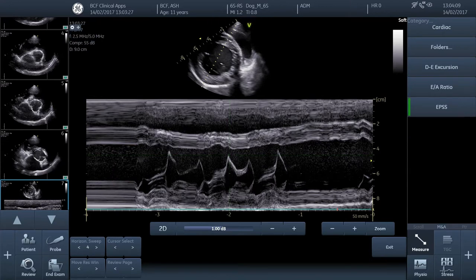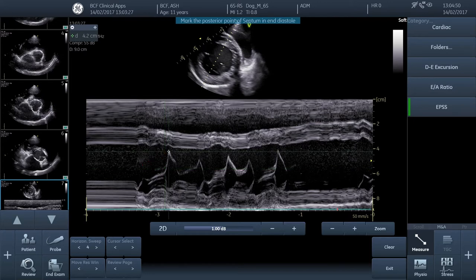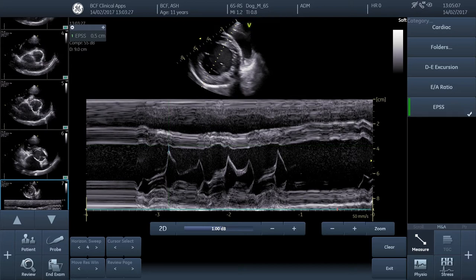The first thing you'll need to do is select EPSS from your measurements menu — the exact way you do that will depend on which machine you have. Once you've selected EPSS from the measurements menu, all we need to do is click our first cursor on the tip of the peak excursion of the septal leaflet of the mitral valve. Then we simply click our other cursor onto the endocardial surface of the interventricular septum vertically above the first cursor, i.e. at the same point in time. The absolute measurement in millimetres is the EPSS, or E-point Septal Separation.